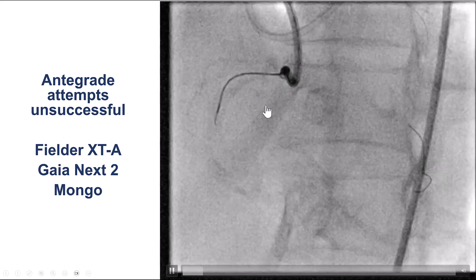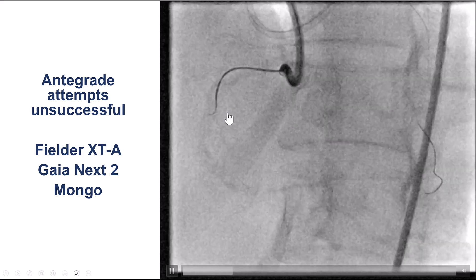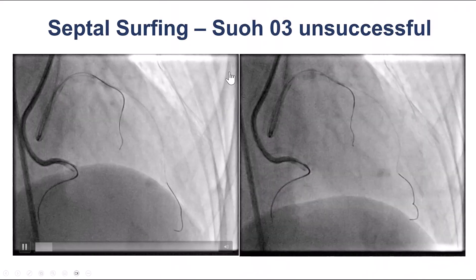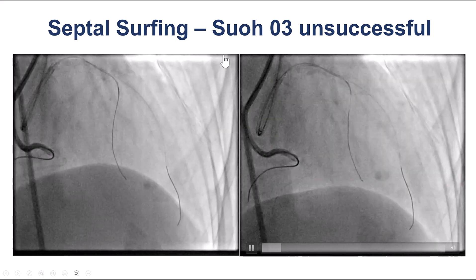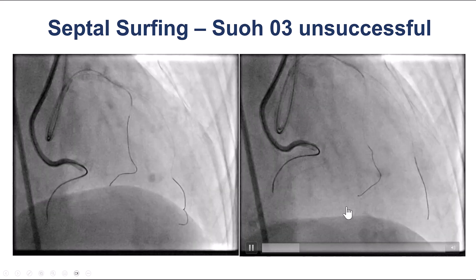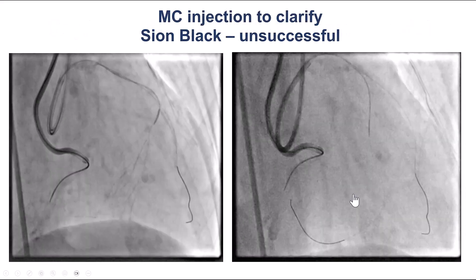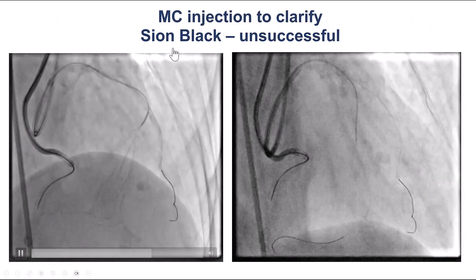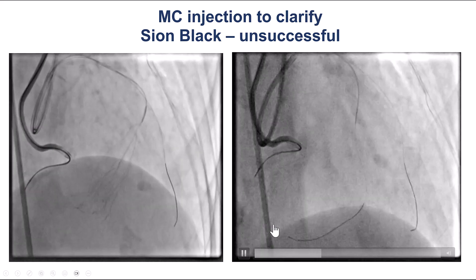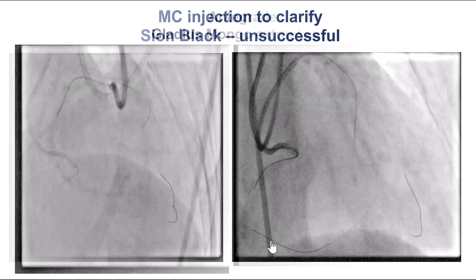We tried with several guide wires antegradely — Fielder XTA, Gaia Next 2, and Mongo — but we could not make much progress, which is not surprising given the calcification. We then tried to go retrograde with the Suoh 03 guide wire, but despite surfing and multiple septals, we could not make the connection to the posterior descending artery. We then switched to a polymer-jacketed wire, but the wire kept exiting from the collateral segment into the cavity, so we could not make the connection to the PDA.